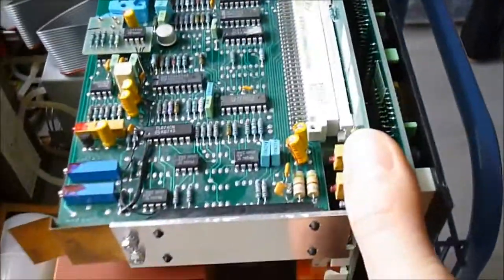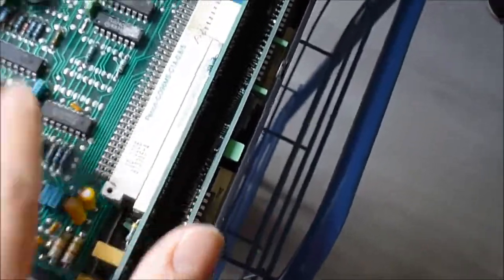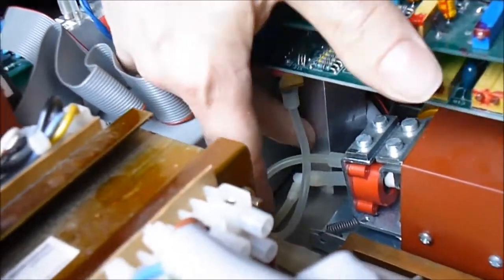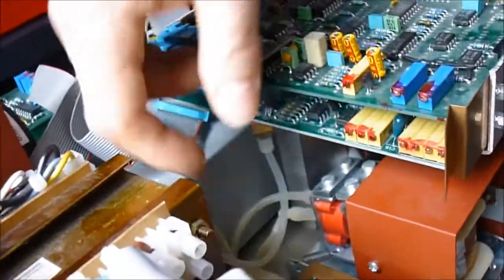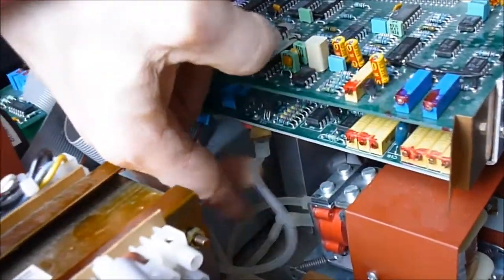So this motherboard can be removed quite easily when you disconnect the wires. It is just a matter of two screws below here, which are held, and also, if you can see it, yes. Look at this here, a very nice aluminum part holding the heat sink here. You can see a pressure sensor on this PCB with a little tube.